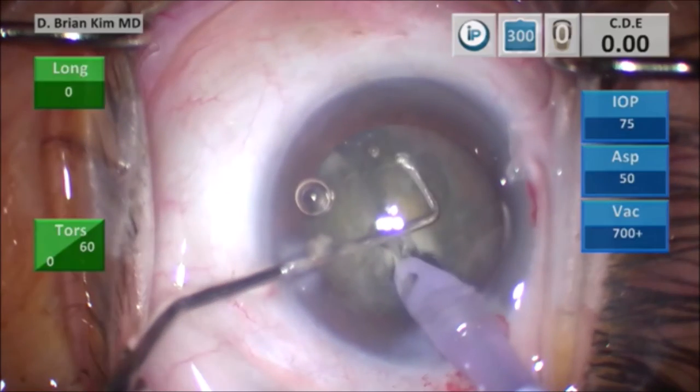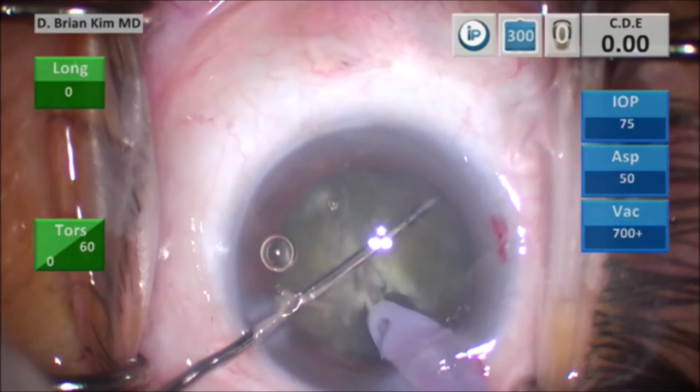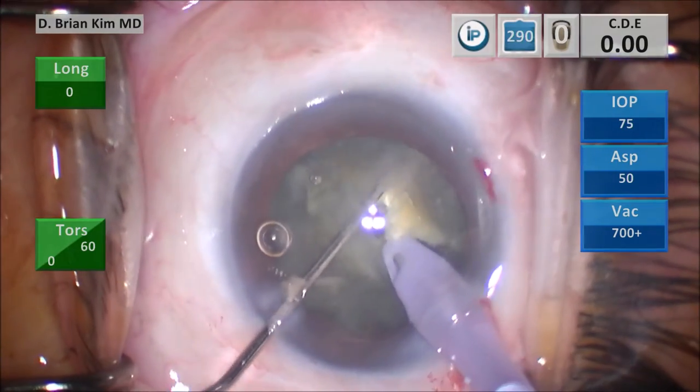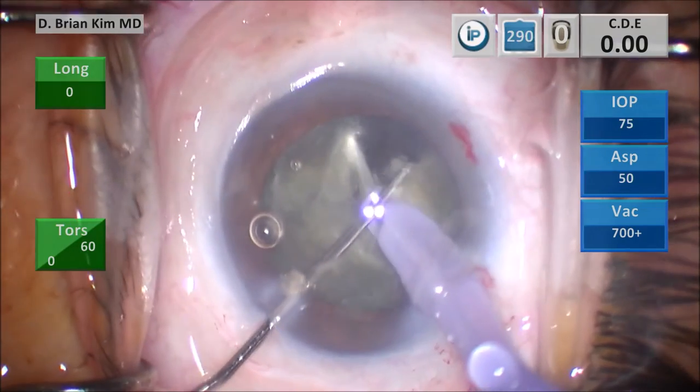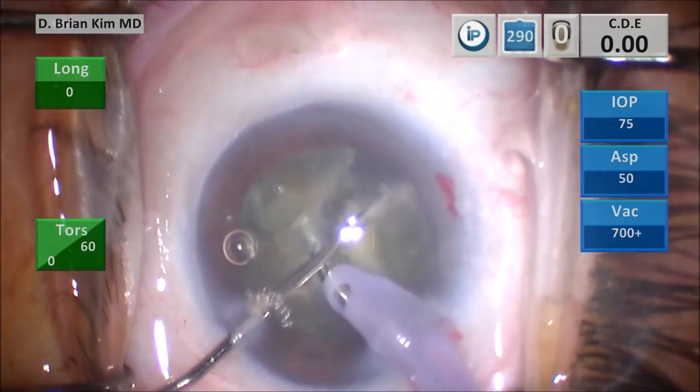I'm going to place the chopper out to the contralateral equator to do the cross-chop maneuver. You can see the epinuclear ridge. I've placed my chopper in the ready position flat on the surface of the endonucleus. I'm going underneath the epinuclear ridge, rotating so the chopper tip is pointing downward, and then I'm going to pull the chopper centrally. As I do this, it meets the phaco tip in the middle and bisects the right heminucleus. I perform more lateral separation, causing the division of the right heminucleus into two pieces.